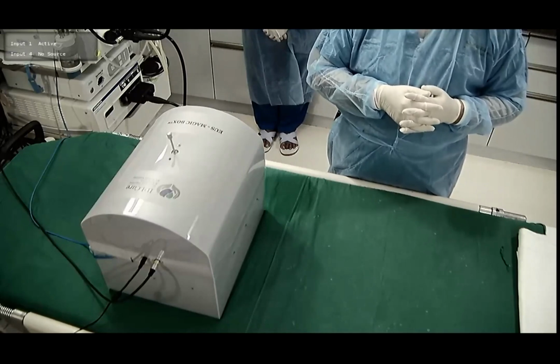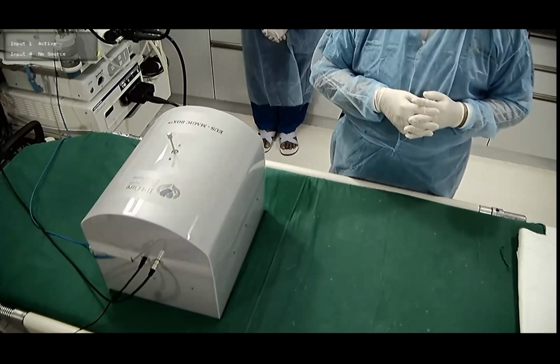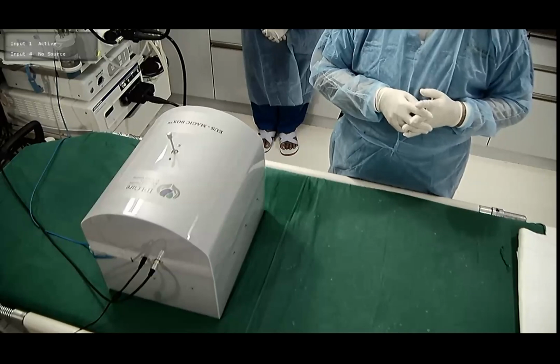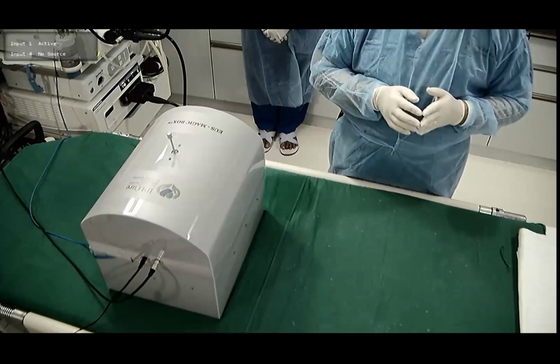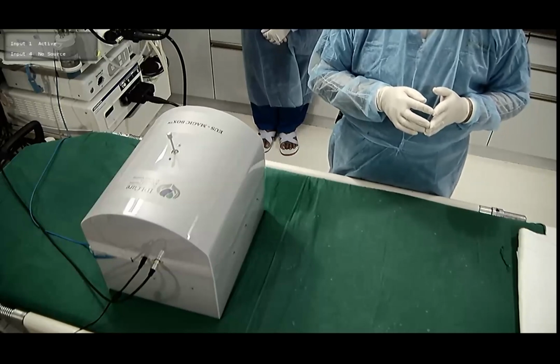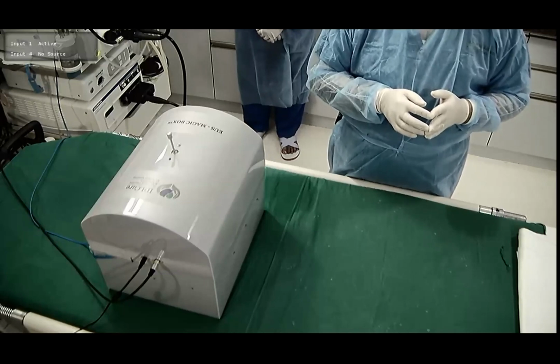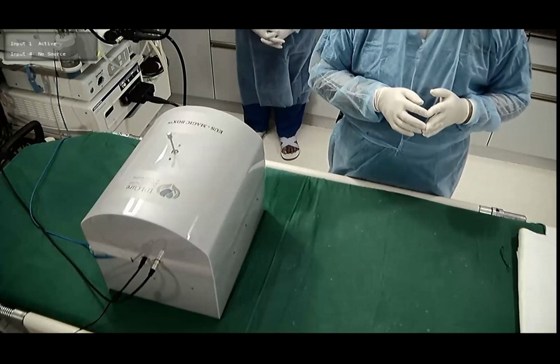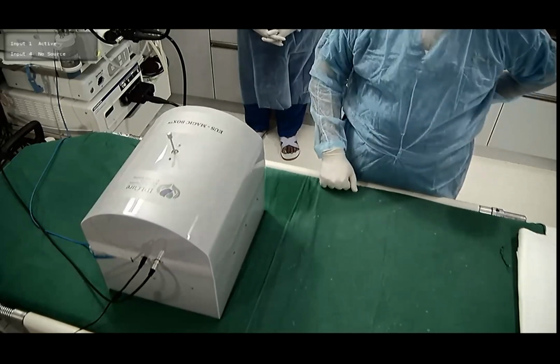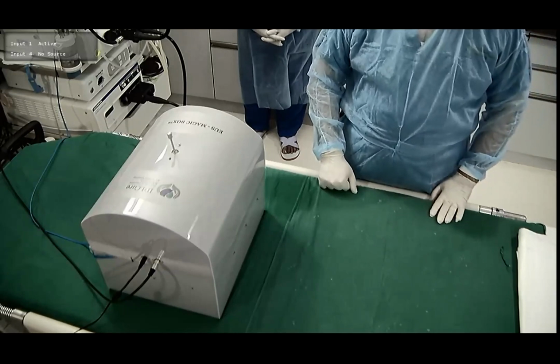And for the last 7-8 years, we have been working to create a model for interventional EUS. The first model that we created was a 3D printed model, and it was just a basic 3D printing image of the bile duct, and we used a pig liver, and we showed the basic steps of EUS-BD, and it was very much appreciated, the model.